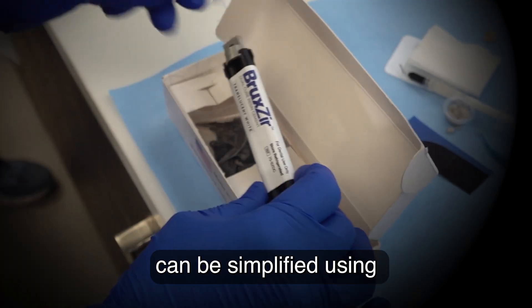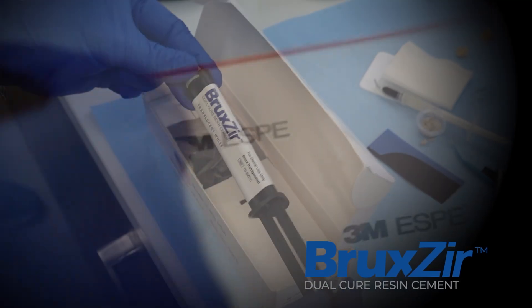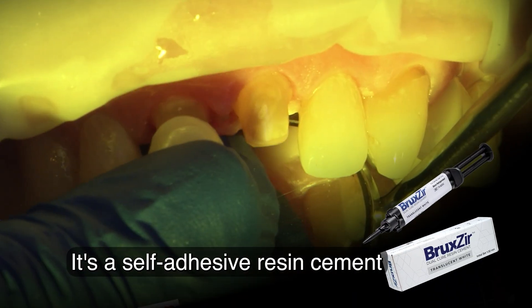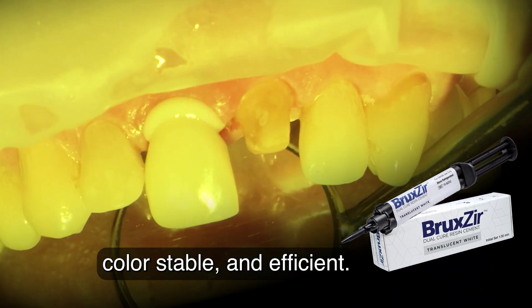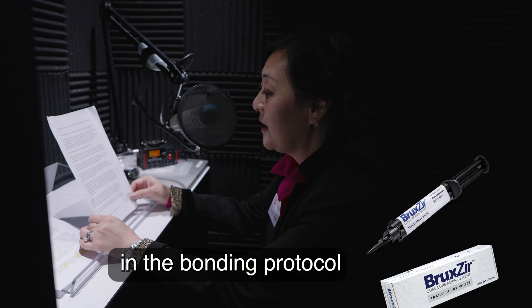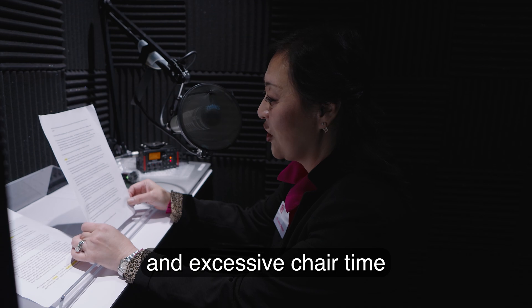Cementing zirconia can be simplified using BruxZir Dual-Cure Resin Cement. It's a self-adhesive resin cement that is versatile, color-stable, and efficient. It eliminates several steps in the bonding protocol, and that saves money and excessive chair time.